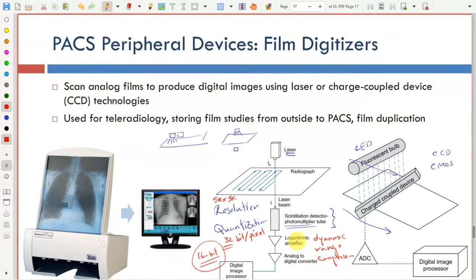What it does is saturate the high echoes first, and then magnify the low echoes. This is very common, and it is used in other applications like ultrasound imaging. It's very useful to obtain a very high quality image without losing the parts of the image that have very low echoes. For example, if you look at this image here, most of the interesting areas are black. So if you lose dynamic range, you're going to see all this area as black. You don't want to do that.